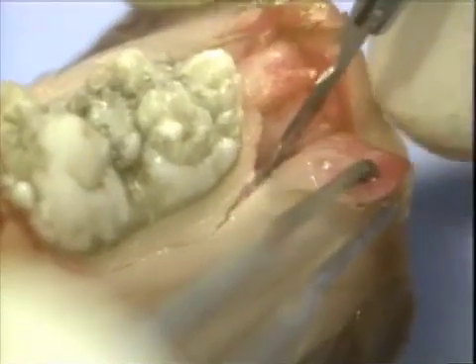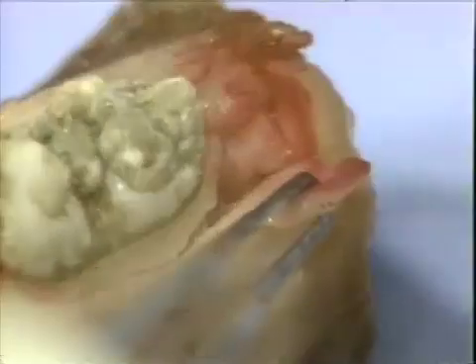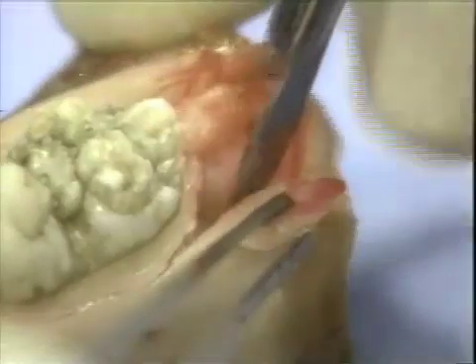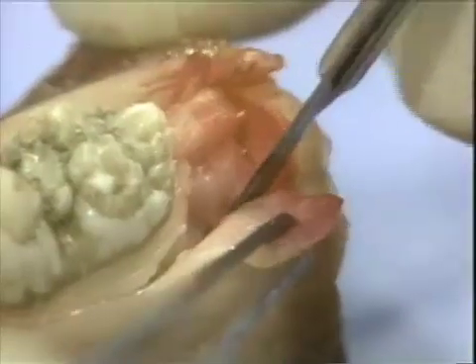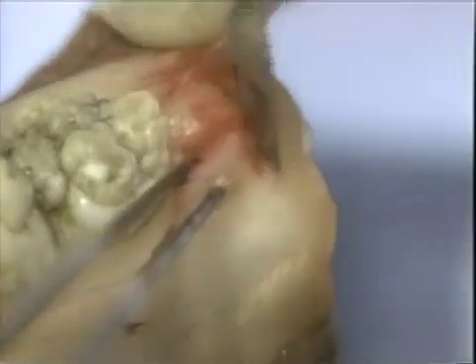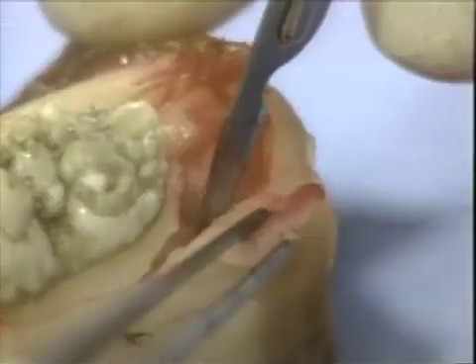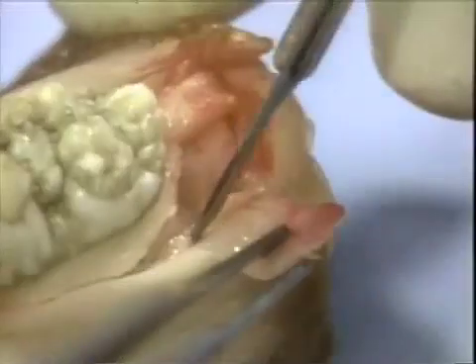It is important that the crestal bone be contacted and that the incision be continuous from distal to mesial, especially at the distal line angle of the terminal molar tooth. This area frequently causes problems in that adequate flap reflection is not accomplished. By using sharp dissection and a continuous incision to the alveolar crest, the flap can be adequately reflected in this area for access and visibility.